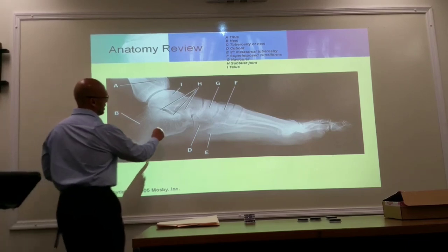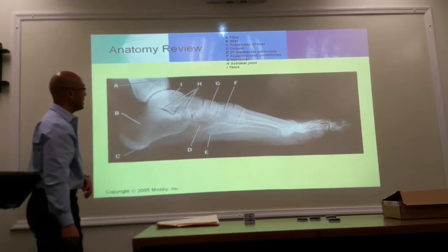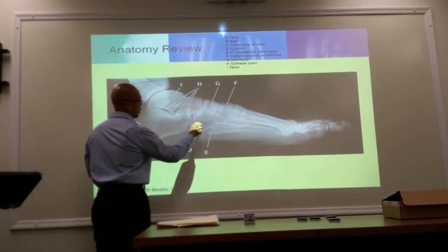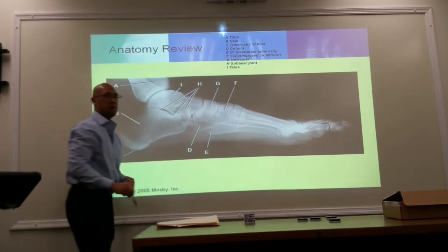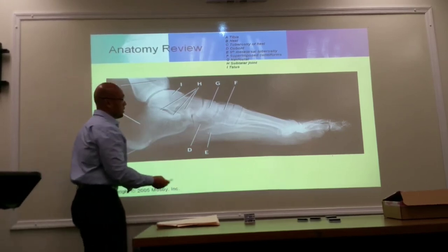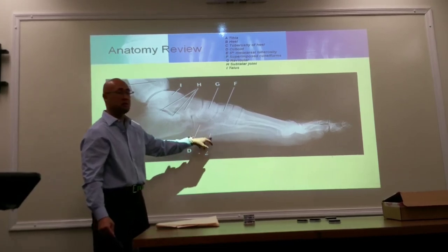What's D? Anterior to the calcaneus, cuboid. Anterior to the cuboid, you should have metatarsals 4 and 5, but we can't see 4, we can only see 5, right?